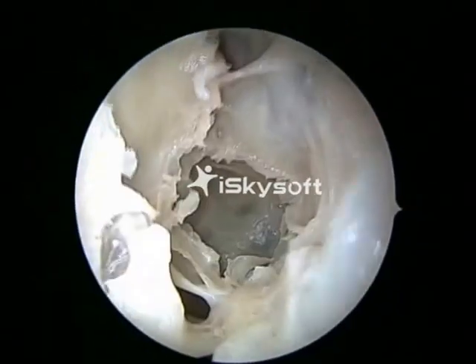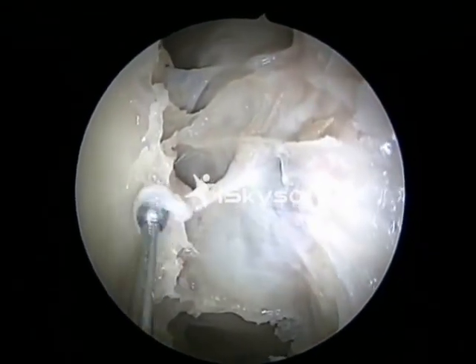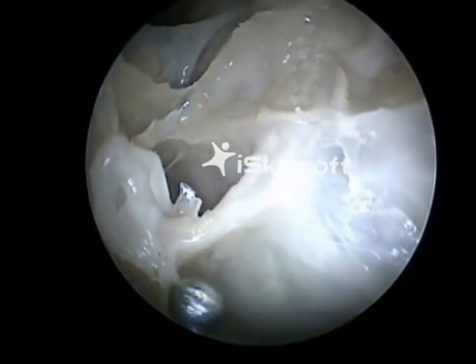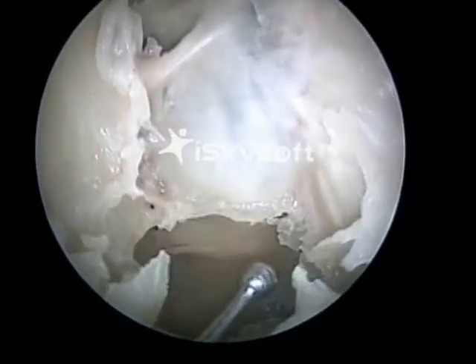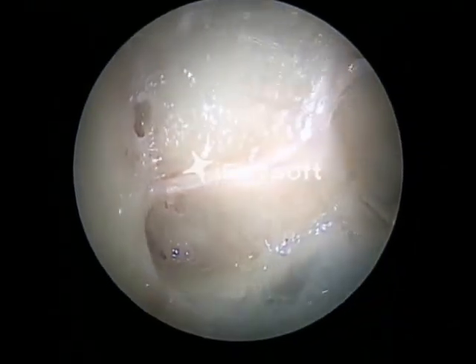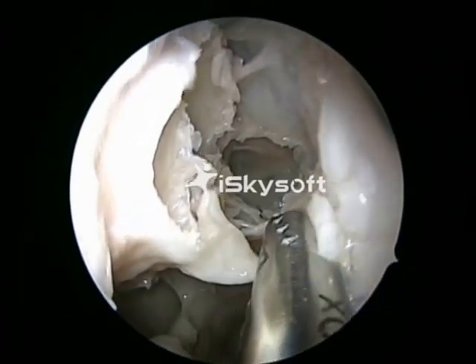We can see that the skull base, the posterior skull base, is tapering downwards. And now that's a 70-degree view. That's the anterior ethmoidal neurovascular bundle, the anterior fovea. That's the close-up view of the anterior ethmoidal artery. That's the posterior fovea, and the posterior ethmoidal artery is seen very clearly there. That's the posterior ethmoidal artery. Roughly corresponds to the anterior face of the sphenoid sinus.